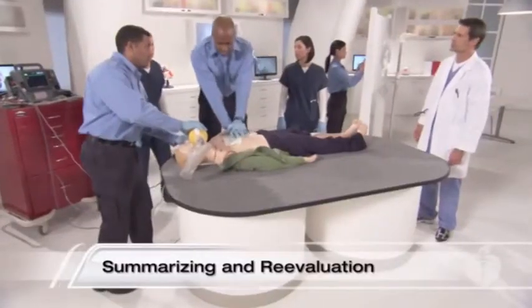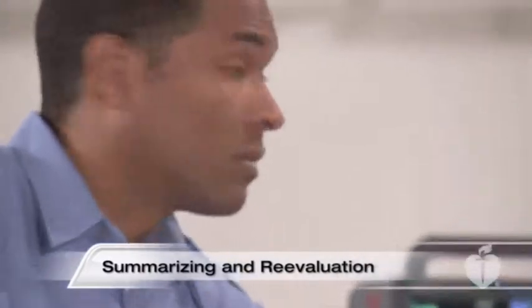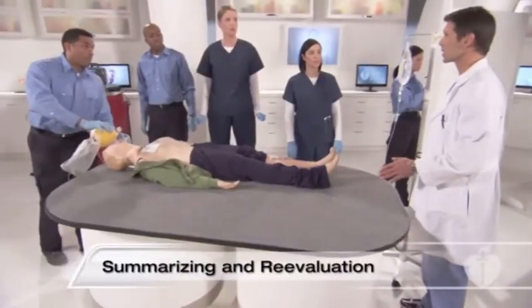2 minutes. Let's analyze. Switch roles. Okay, the monitor shows sinus tachycardia. Sam, do we have a pulse? I can feel a rapid, weak pulse. Okay, great. Let's initiate immediate post-cardiac arrest care.